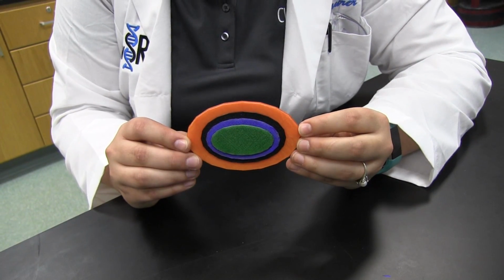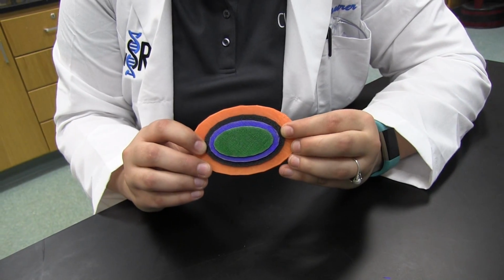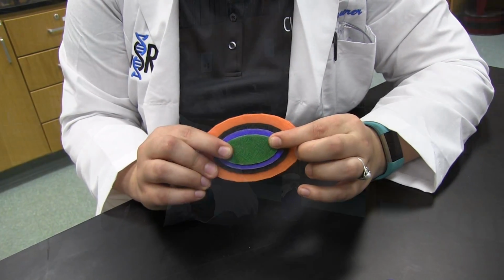My part in the project was to create a bandage that was perfect for each patient. Again, found through the dimensions and sent to the 3D printer so that I could find a way to make the perfect bandage. In our project, we wanted 5 different layers. The red being the fabric, the orange being the adhesive, and the last 3 of the black, the blue, and the green as the different bioactive glasses.